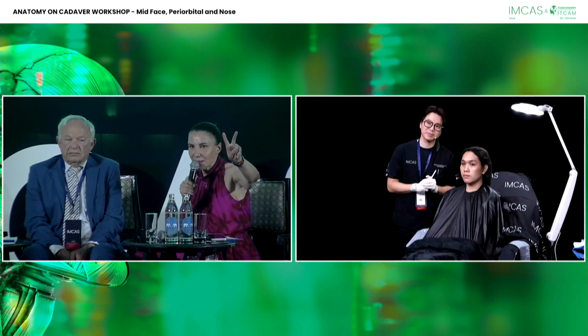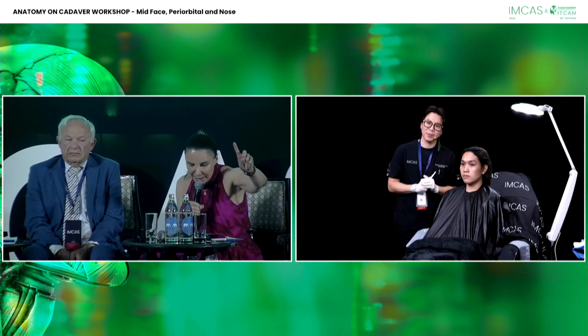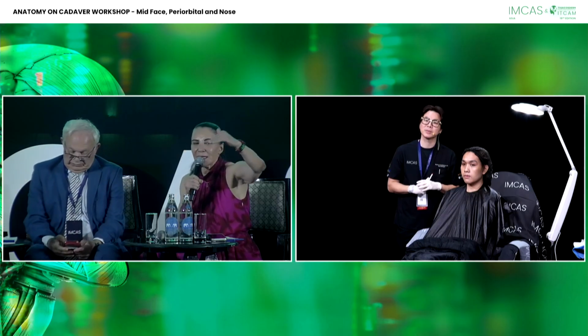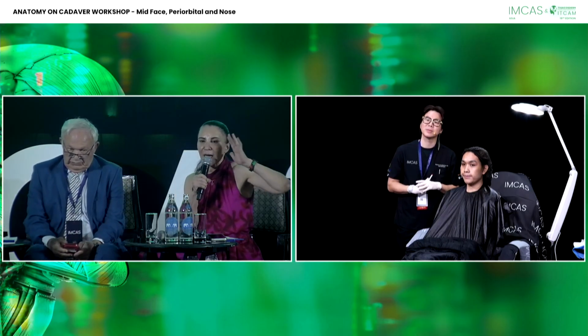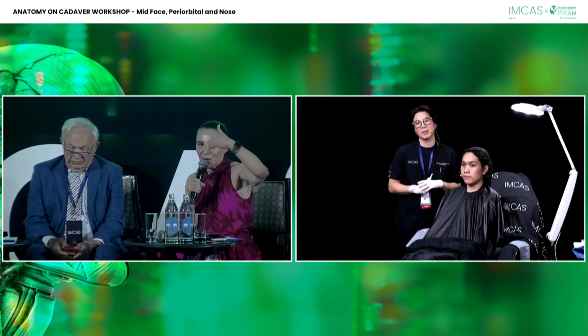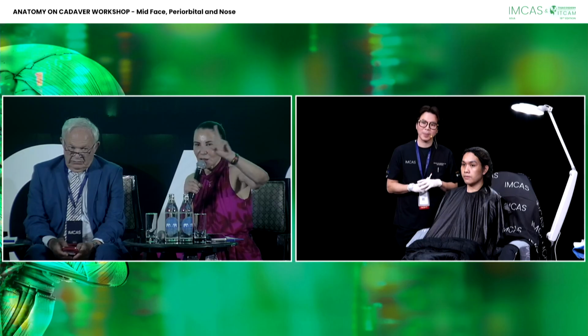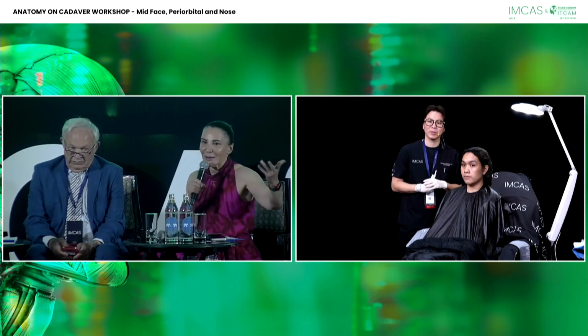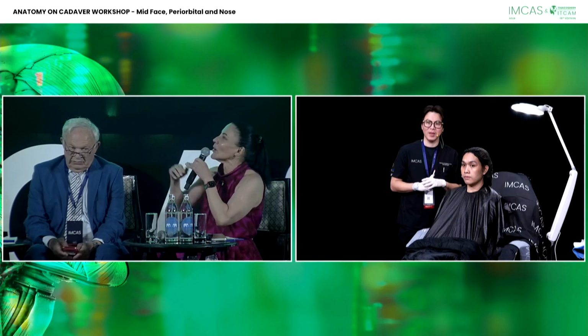Yeah, because we have two injectors, what I would be suggesting is that Duangao, you can please treat one side of the mid face of the patient offline, and then when we get online, we will see the other side and we will be able to compare. You don't inject the nose because we have only one nose. And we go to the ultrasound, please, Maurizio.